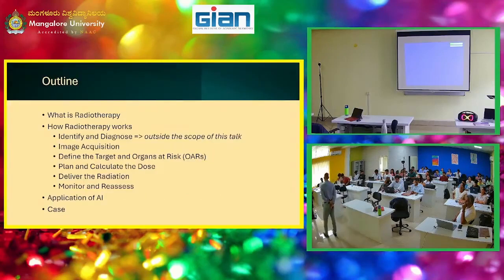So radiotherapy is something that, hopefully none of you have experienced, and hopefully you will never experience in your life. But unfortunately, you may, or someone in your family may. And you would think that radiotherapy is something that's very precise. But it's not. It has definitely improved. But unfortunately, it's very challenging to expose the exact targeted area in which you would like to treat.